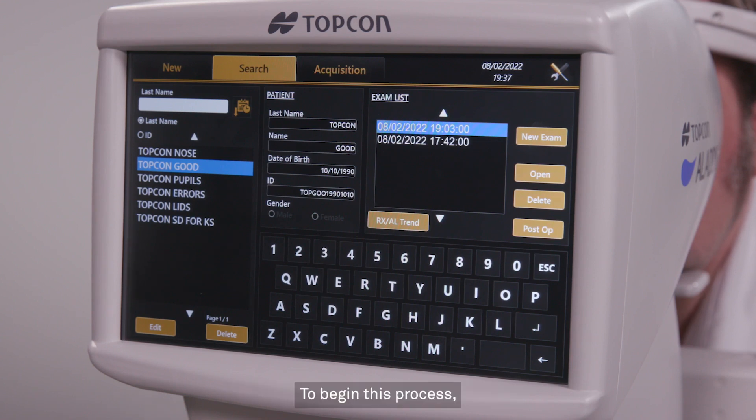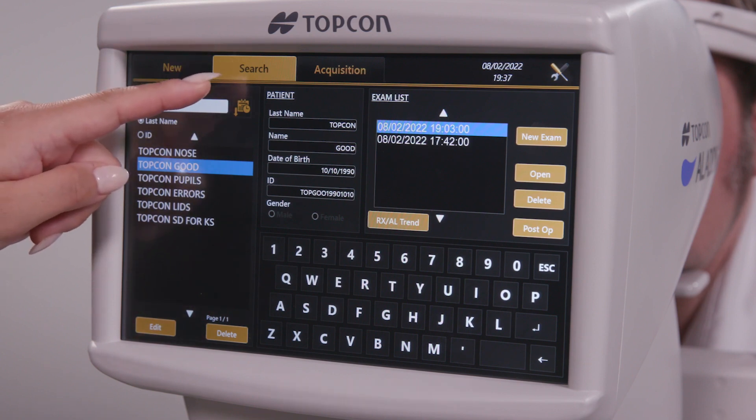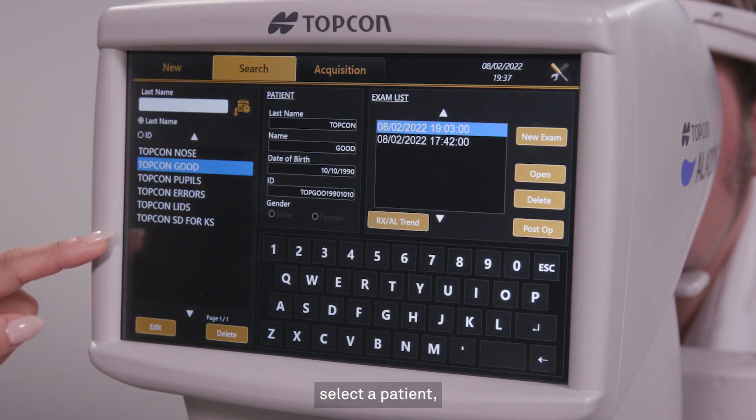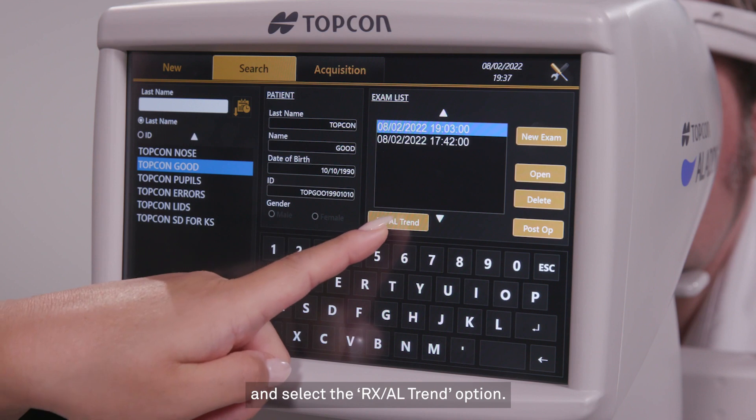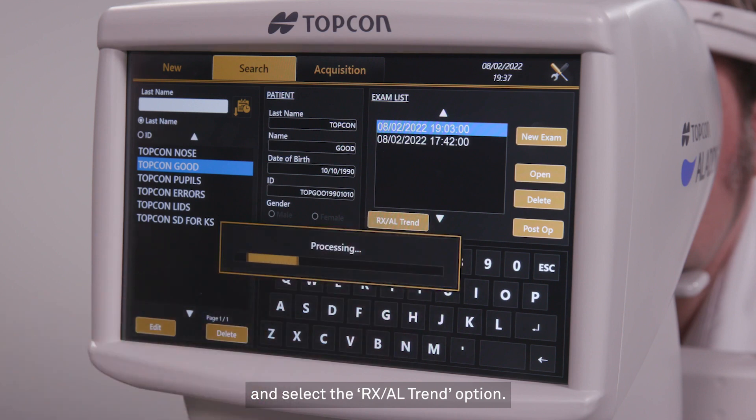To begin this process, simply go to the search tab, select a patient, and select the RxAl trend option.